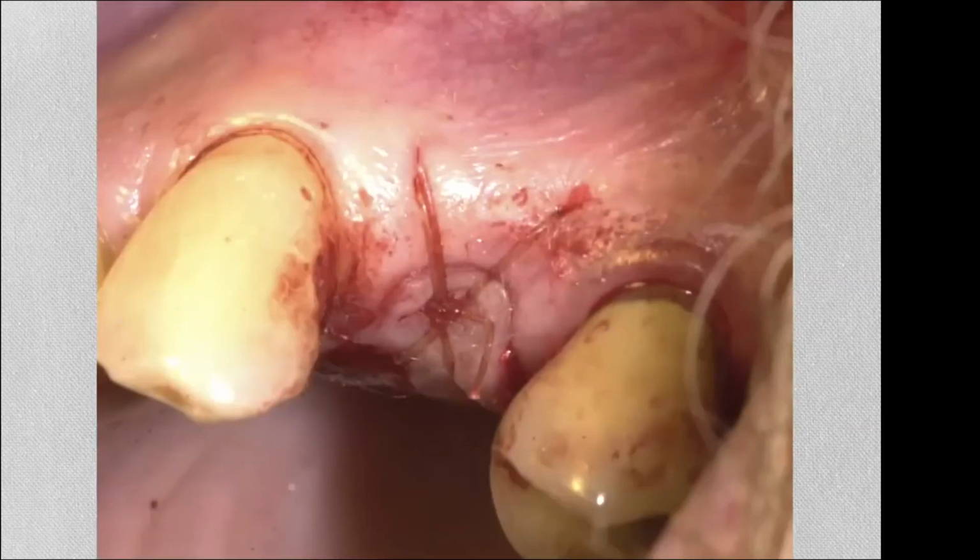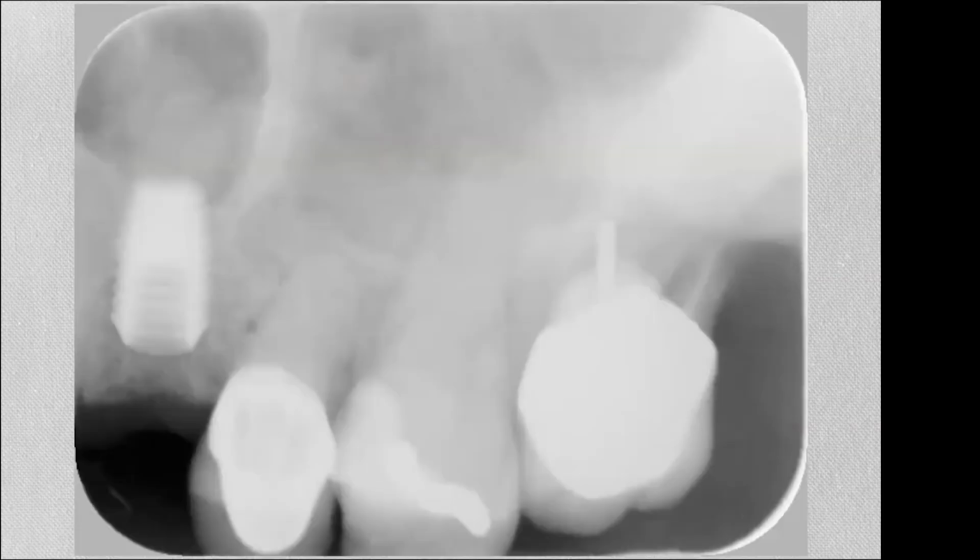So this is where we learn our lessons, right? This is a relatively old case. Those little pieces of the graft that are stuck here and there can become annoying to the patient. That's where we switch to saving the autogenous bone for the crestal component. So this is what we end up with. The implant has a sinus lift, and the sinus lift is contained. All right. The septum is pushed to the side, and the implant is in place.